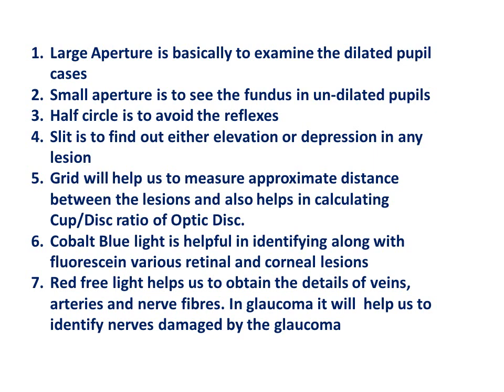So red free light helps us to obtain the details of veins, arteries and nerve fibers. In glaucoma, it will help us to identify the nerves that are damaged by the glaucoma. These nerves will be much lighter than the normal nerves which are not affected by the glaucoma. This is the help of red free light.